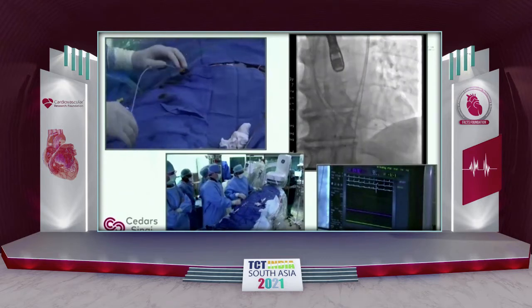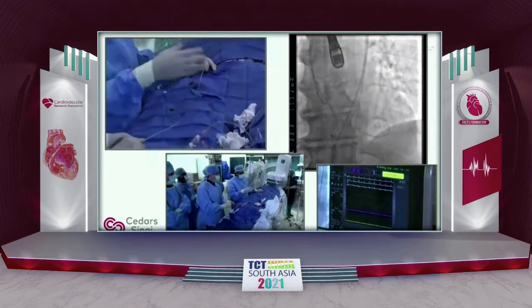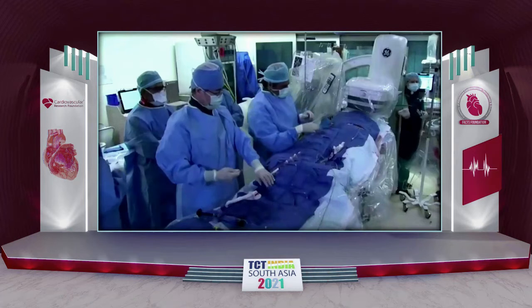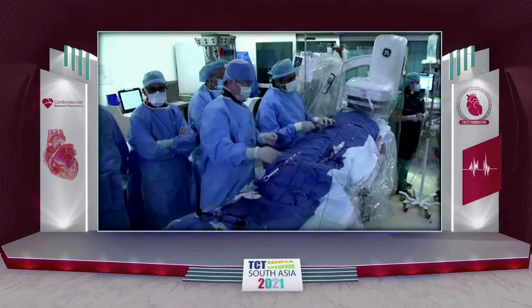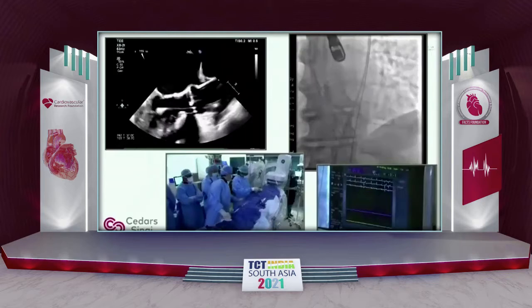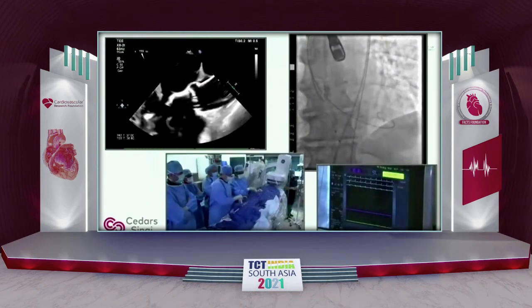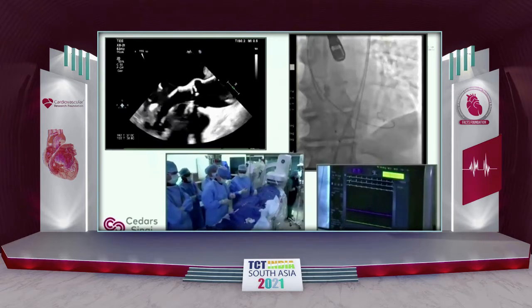These are generally the steps that in our lab are done by our fellows, crossing of the valve, even advancing the catheter system. Okay, so taking an aortic root shot sometimes will help in seeing the pinpoint hole where it is, and yes, in fact it does. We showed you a picture at baseline where we took a picture, but you're right, it can actually help. Putting your pigtail catheter in the non-coronary cusp all of a sudden orients you to that space, and giving an injection also helps.